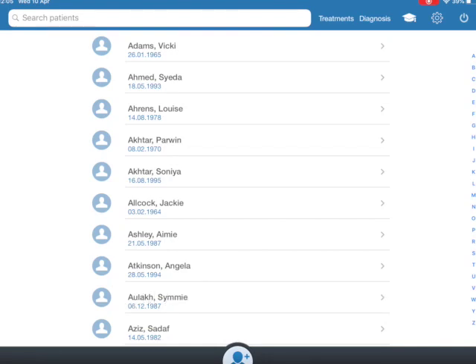I think it's a really good bit of software. It makes it so much easier to archive your photos, which is the main reason I got it, because I was spending hours archiving the photos. But it's safer for us as doctors to have the images on the cloud rather than on our device, and it's also easier and safer to share with patients.